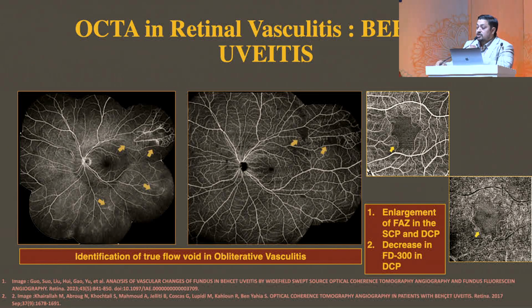Now, as has been discussed previously, the OCT angiography cannot show leakage. So how do we diagnose diseases like Behçet's uveitis or any other uveitis? First, OCT angiography is not affected by the leakages, and you can clearly see the CNP areas. And as we have evolved in time, we've understood that the decrease in the vessel density in the superficial as well as in deep capillary plexus around the FAZ can tell us that the disease is progressing. So if you see that although clinically the disease is not progressing, but it is there, this means the treatment needs to go on.